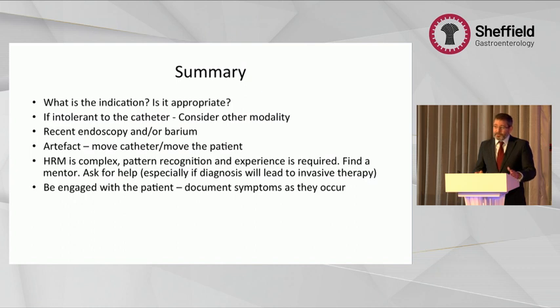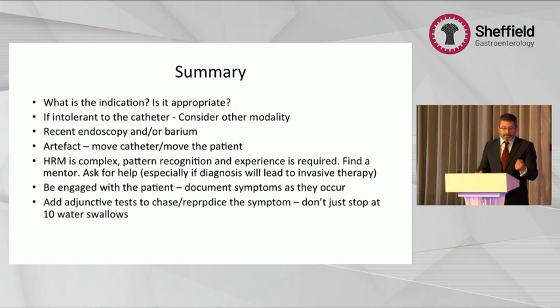Be engaged with the patient. Please try and follow and chase the symptom. Don't just do 10 water swallows and pull the catheter out. That's bad medicine. We need to ask the patient, what's the problem? Is the problem dysphagia? 5 ml water swallows isn't working? Okay, let's do some free drinking. Let's do some solid swallows. Let's move you from supine to upright to supine, what have you. Try and give the patient the best chance possible to find the problem.